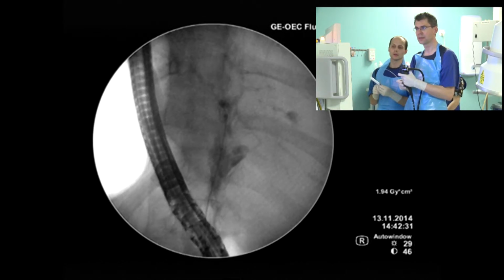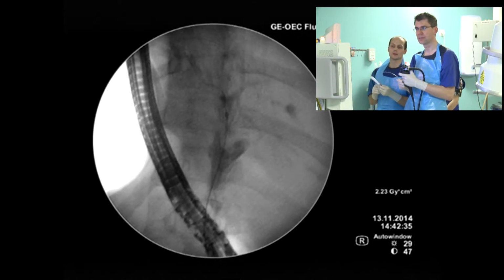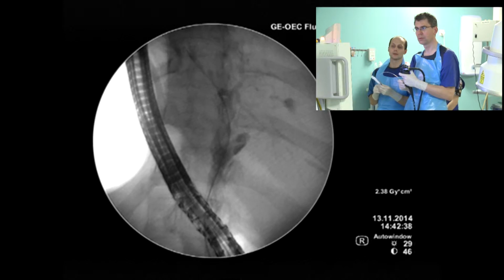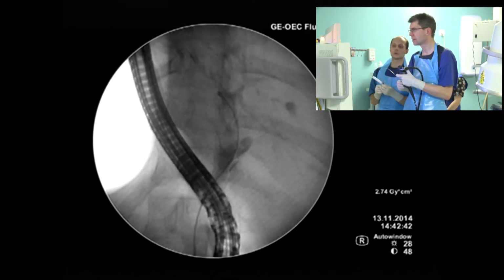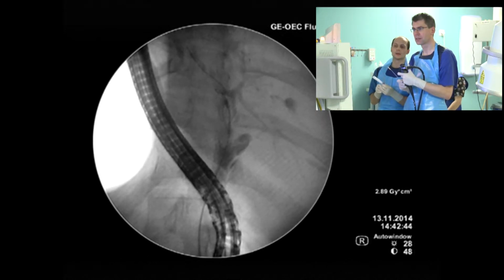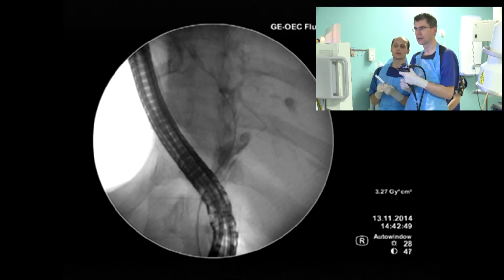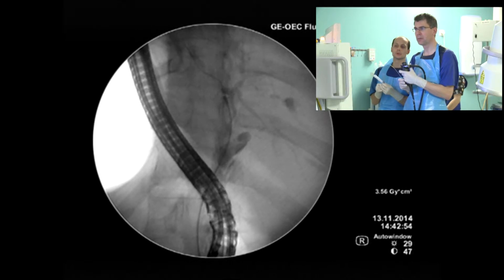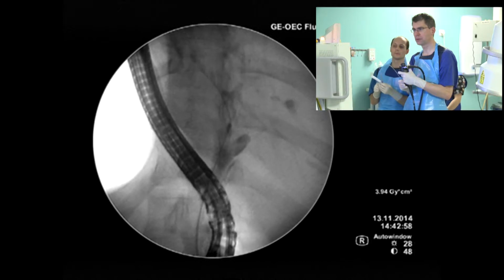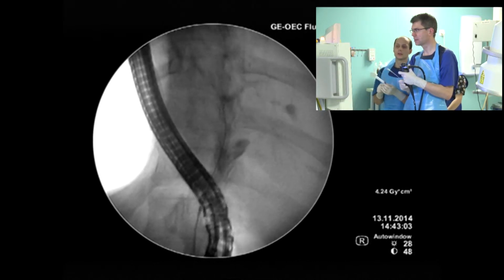Yeah, there you go. That's okay, that's good. So pull, pull me. Just a bit. I should say here is a special catheter of Olympus, which makes it possible to use a manageable steering catheter. Change, please. Push the wire while I pull the scope. The catheter, sorry. Okay.